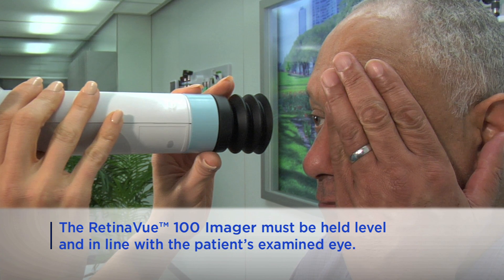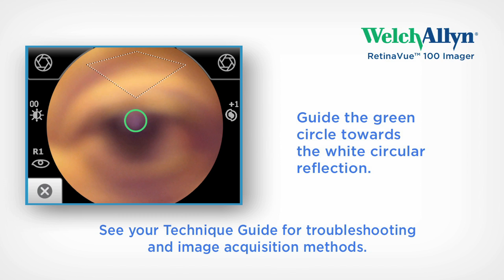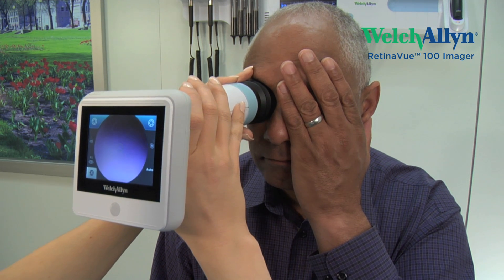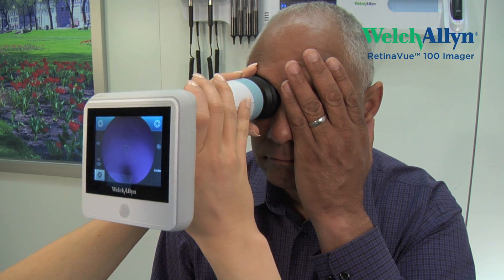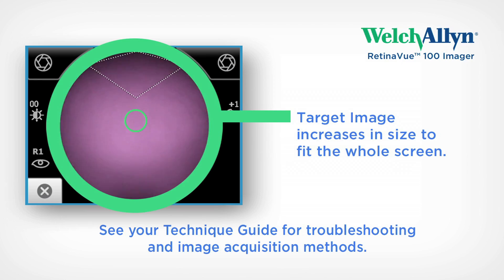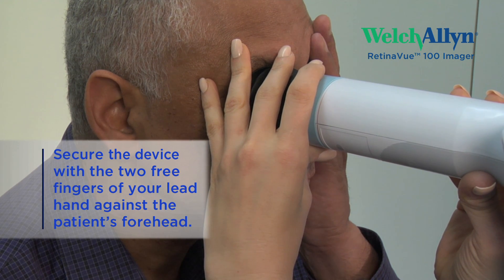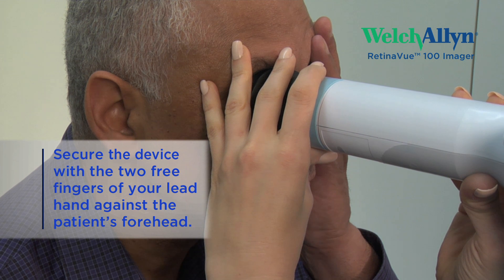Search for a white circular reflection at the top of the eye image displayed on the LCD screen — this is your initial target. Guide the green circle on the RV100 LCD screen towards the white circular reflection by slowly moving the RV100 towards the eye. The collapsible eye cup will begin to compress against the patient's eye socket and the fundus image will increase in size until it fills the screen. Use the two free fingers of your front hand to secure the device by resting them on the patient's forehead.